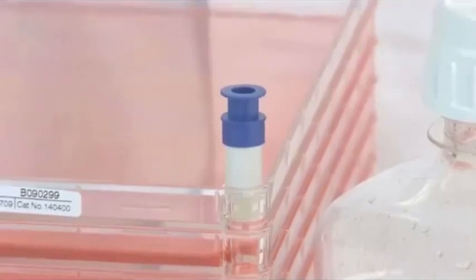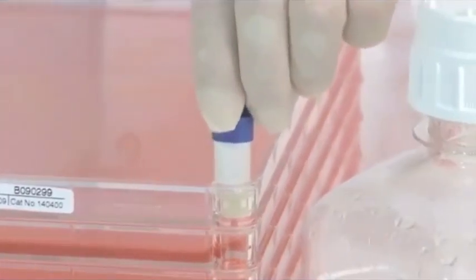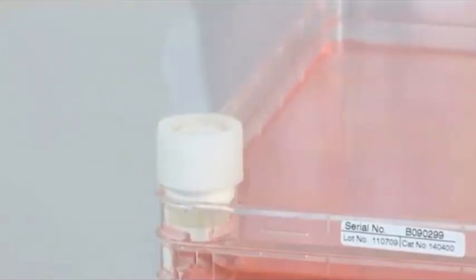To empty the EasyFill Cell Factory System through the smaller port, remove the blue cover cap and loosen the white vent cap approximately three quarters of a turn. Then, simply pour the medium into the bottle.